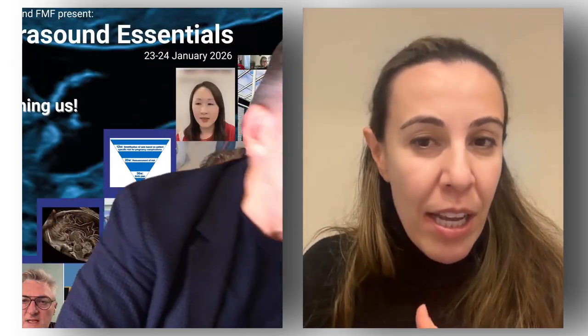What's the view? Yeah, I think whenever we talk about this subject in webinars or at the conference, the way we image young people often comes up, and I think there's going to be a vast different answer on the whole. But from my perspective, I don't think there's really a need to do a transvaginal or transrectal ultrasound scan in a pre-pubertal girl. Post-puberty and when girls have menarche, I would say it's all about patient counseling.